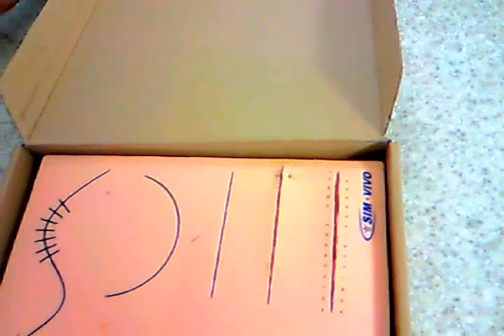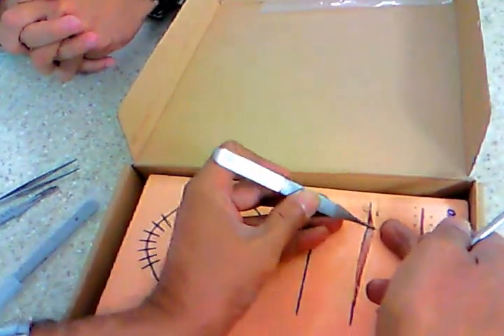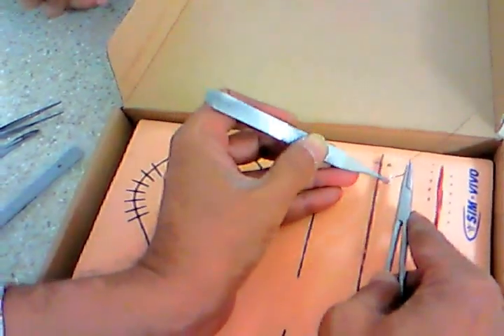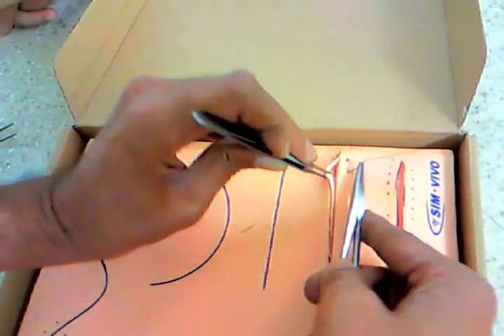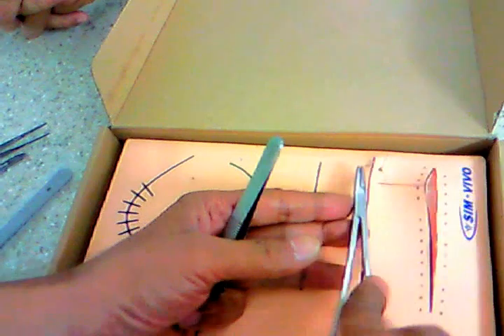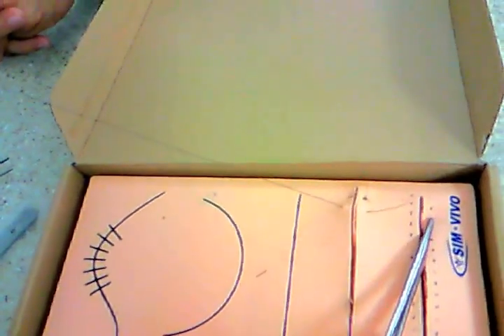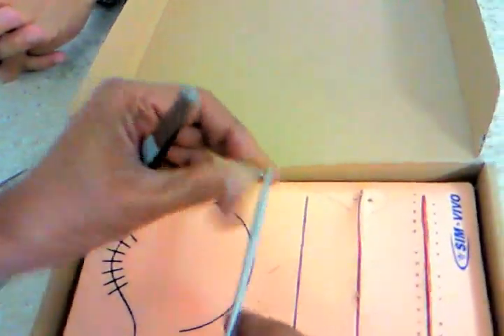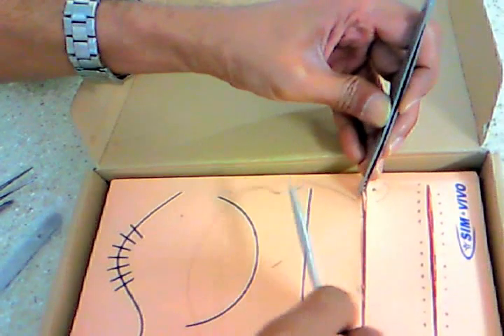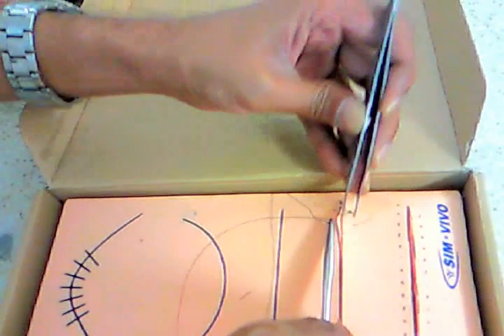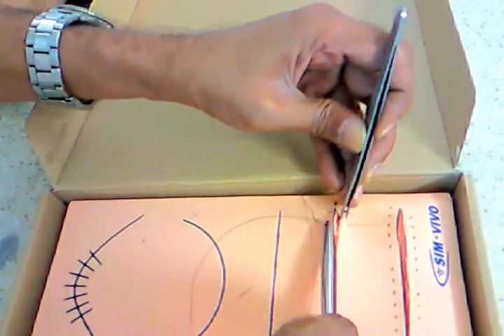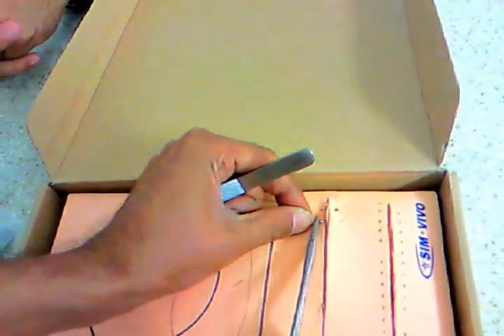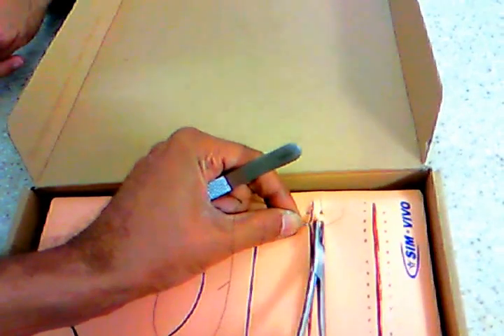I'll take another one. Now watch carefully. First bite, as usual, approximately half a centimeter away. Next one, full thickness. Reverse. Hold it close to the tip. Take the dermo-epidermal junction. Take the other side dermo-epidermal junction. Give it a little push till the apex comes out.